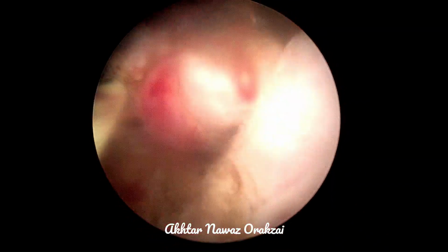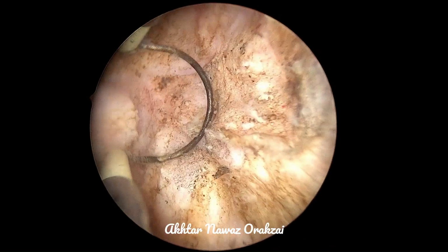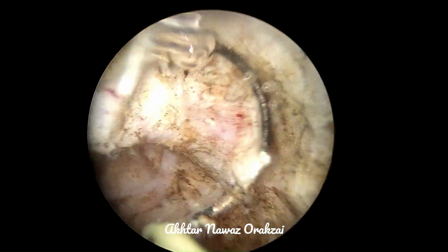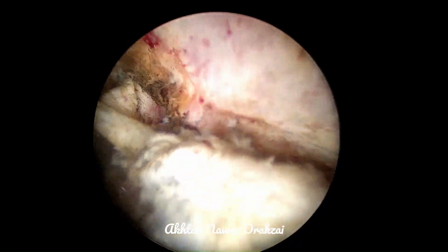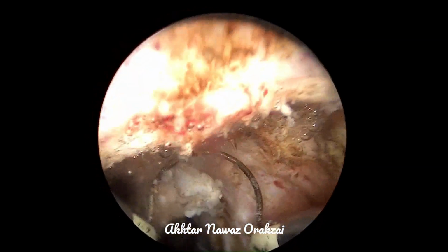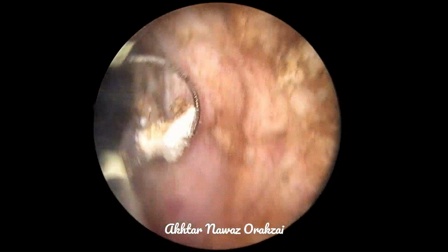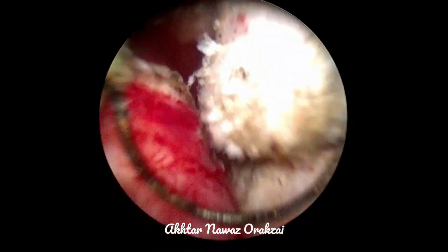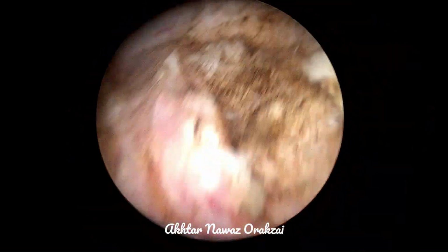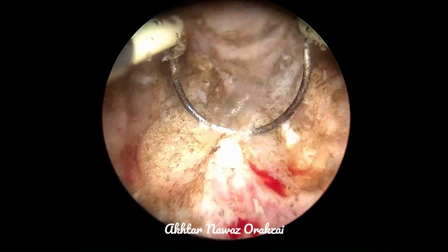So a good channel is made here. Hopefully this will make the patient symptomatically better, and also not compromise his erectile function and will not cause retrograde ejaculation. Plus we will have histopathology as well, although his serum PSA is 5.1. The most tricky is the area near the verumontanum.